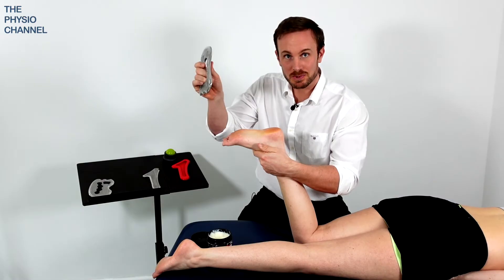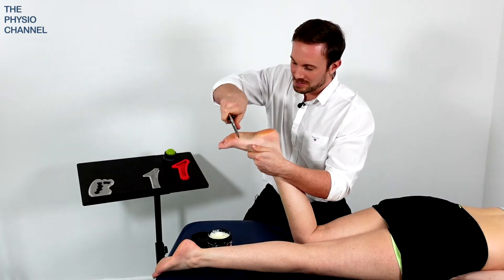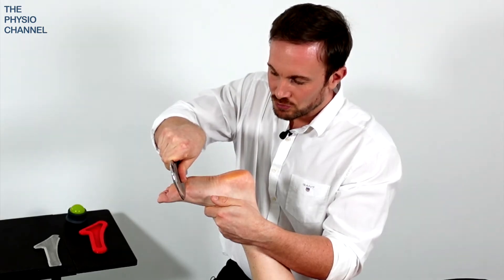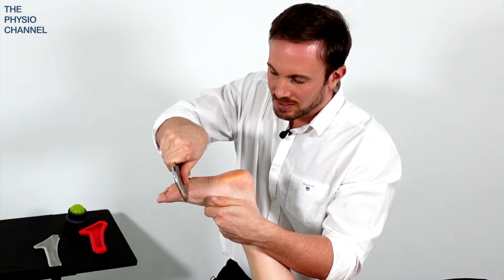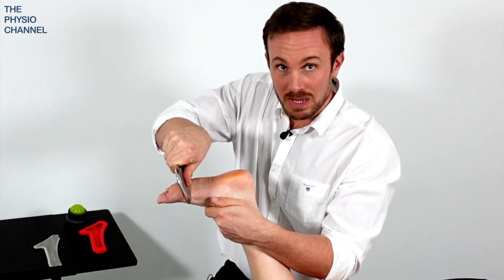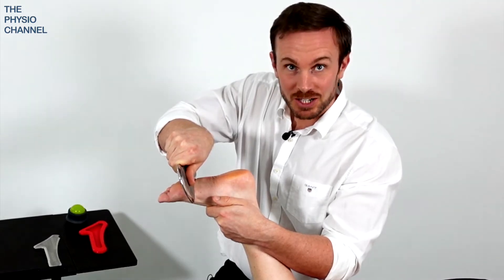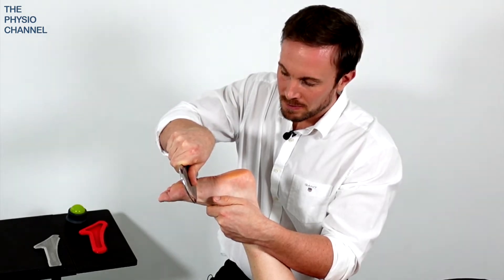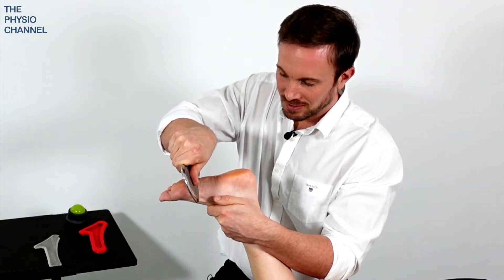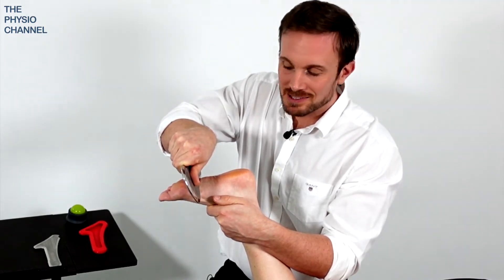Then I'm going to take my instrument assisted soft tissue mobilization tool. Here we have the rock blade and I'm going to start at the front of the foot, drop down into the arch of the foot. The arches I'm referring to here are the medial longitudinal arch and the lateral longitudinal arch as well. I'm going to apply light to moderate pressure and move slowly through the sole of the foot.